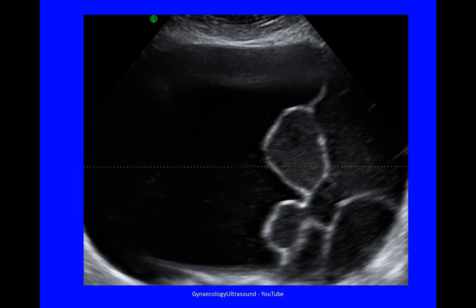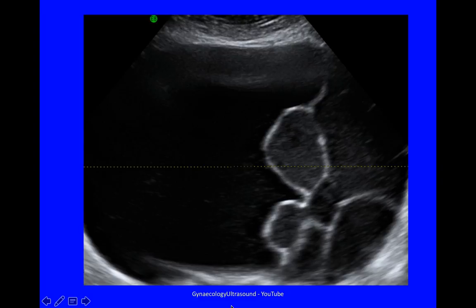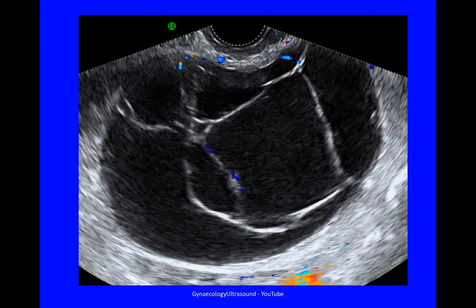This cyst was very large at 204 millimetres — multilocular with fewer than 10 locules, low level echogenicity varying between the locules, no solid material, and I can't comment on shadowing in this image because I can't see behind the cyst. The next cyst was 115 millimetres — multilocular with more than 10 locules, no solid material, low level echogenicity, minor vascularity showing a score of 2, and no shadowing.